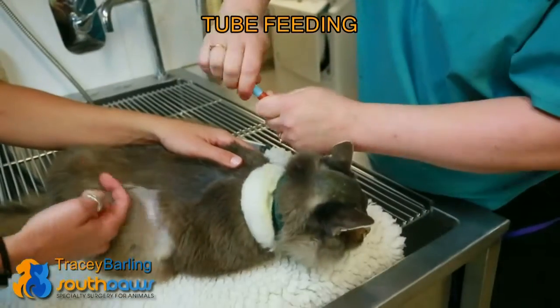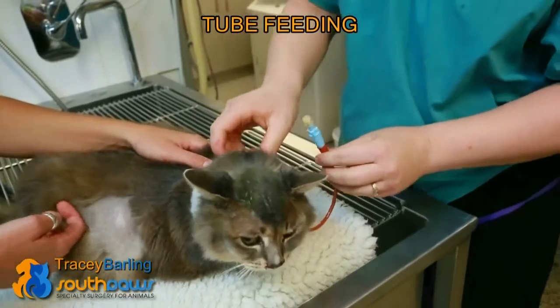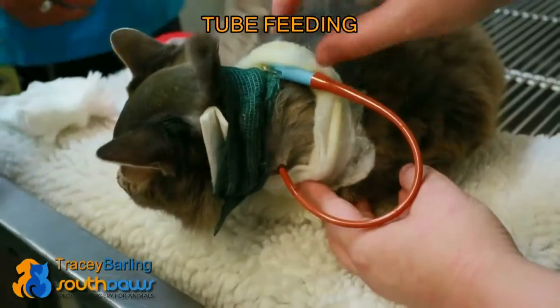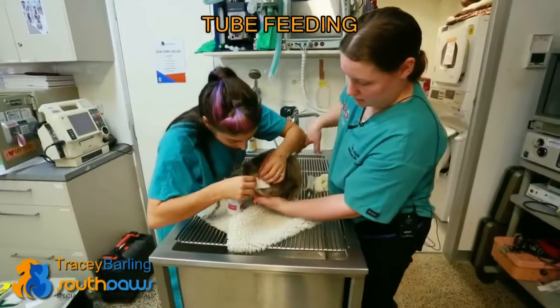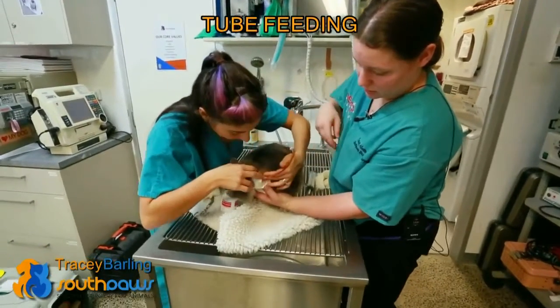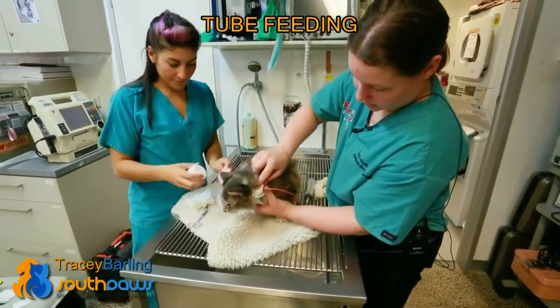The infection risk with having a feeding tube is at the point of entry into the neck, so it regularly gets a bandage change and we clean around the point of entry. We've cleaned it and now we're just going to re-wrap it and place a clean dressing on there to keep it clean.